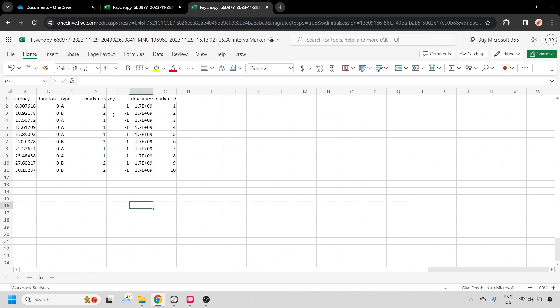We can also open up the interval marker file, and we'll see that the latency from the starting of the experiment and the label as well as the value that we added during the experiment, so that we can identify what tone played during each time.